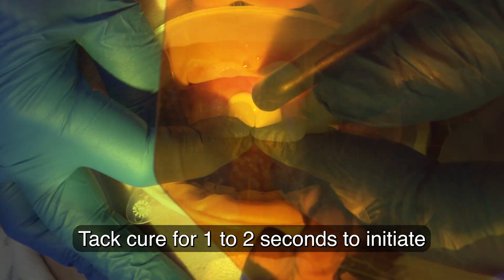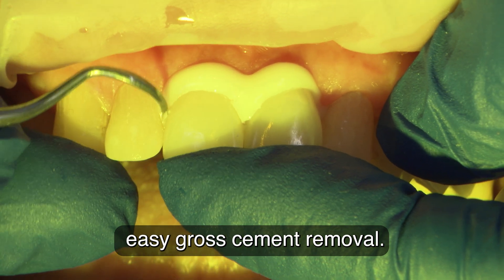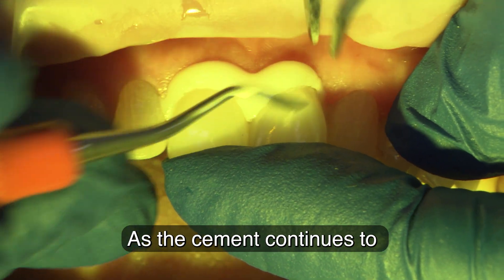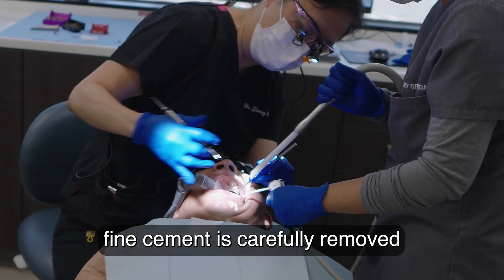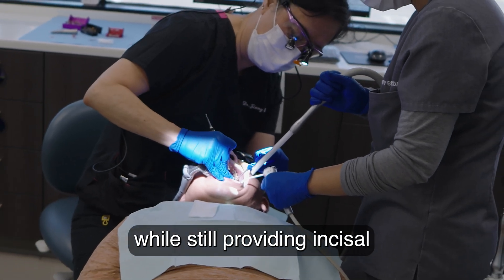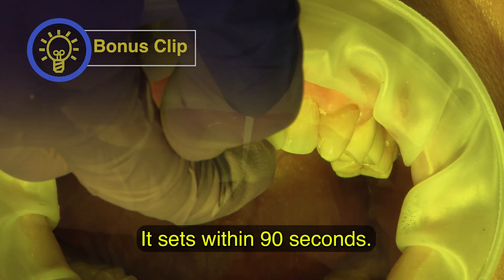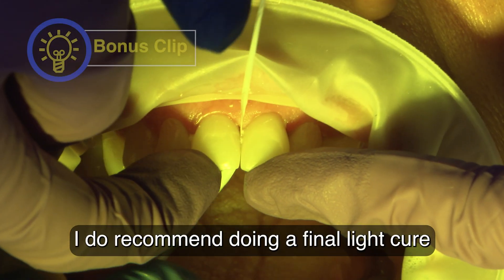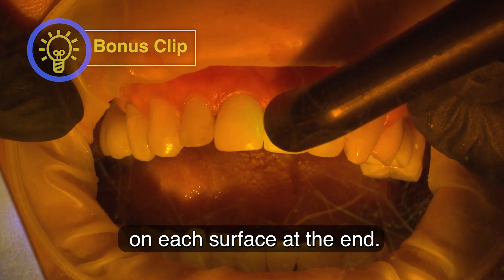Tack cure for one to two seconds to initiate a gel-like state for easy gross cement removal. As the cement continues to set on its own, fine cement is carefully removed while still providing incisal or occlusal pressure. Without light curing, it sets within 90 seconds. A final light cure of 20 seconds on each surface is recommended at the end.